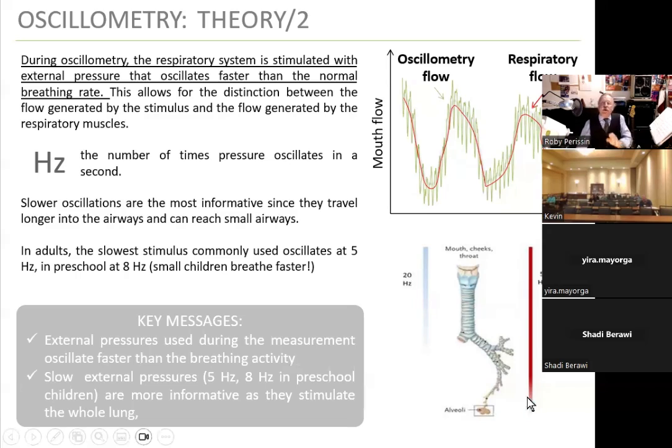This is really simple. The frequencies that this loudspeaker generates travel in the lung. The loudspeaker vibrates at different frequencies, which is called multi-frequency. But what's important is that the lowest frequency is the one that travels the farthest away, like seeing a storm on the horizon and hearing the rumble before you actually see the flashing, because those are the low frequencies.